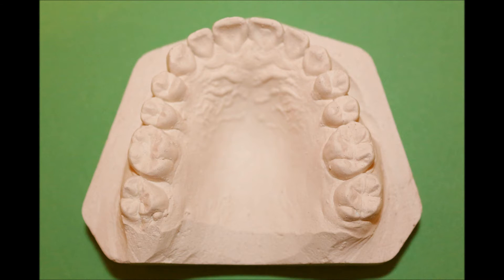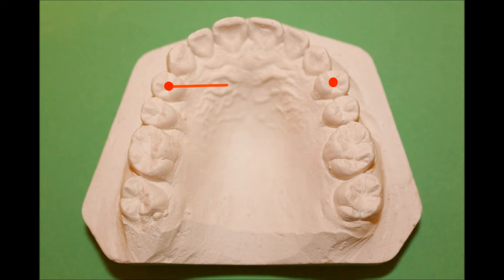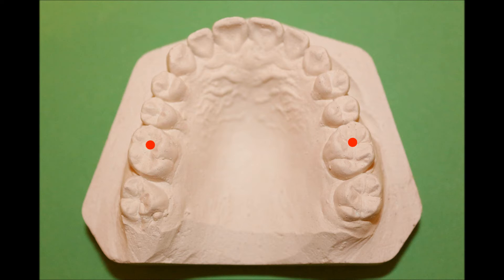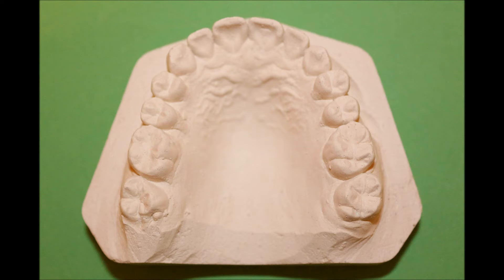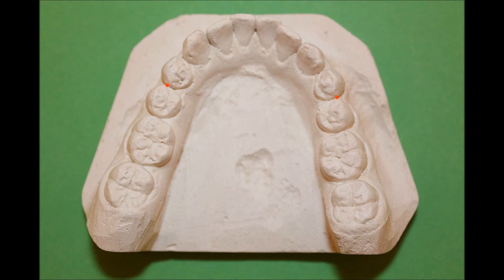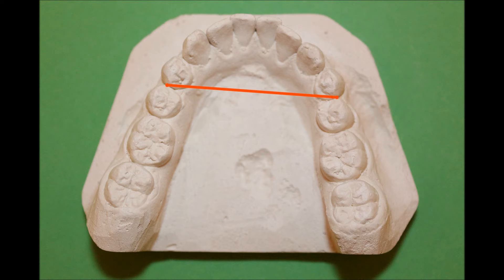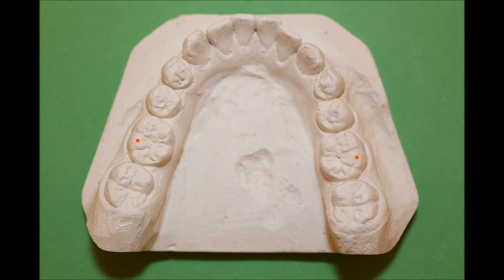Measuring points on the upper jaw are located in the middle of the occlusal groove on bicuspids and in the mesial fossa of the longitudinal groove on the first permanent molars. On the mandible, measuring points are at the contact point between the first and second bicuspids and in the distal buccal cusps of the first permanent molars.